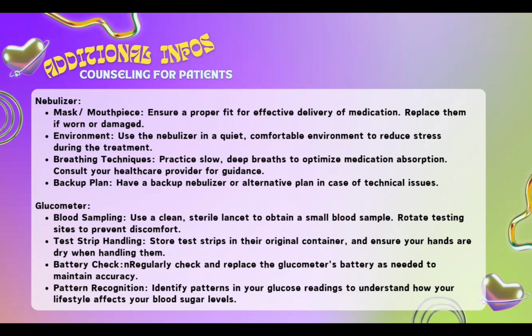Additional information for glucometer counseling of patients. Use a clean, sterile lancet to obtain a small sample, and rotate the testing site to prevent discomfort. The use of a new lancet is advisable, or use your lancet only once and discard it after use.